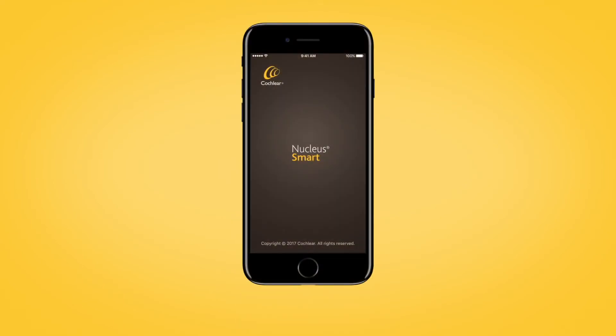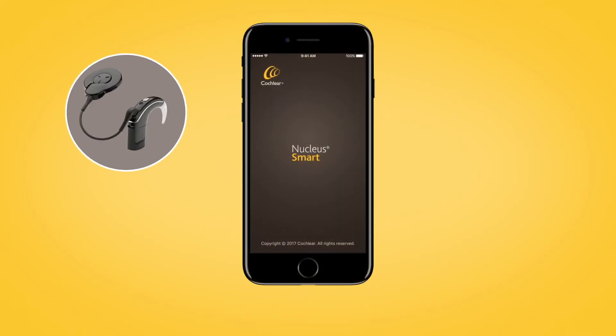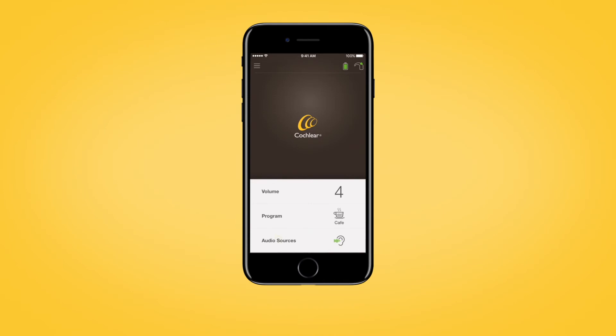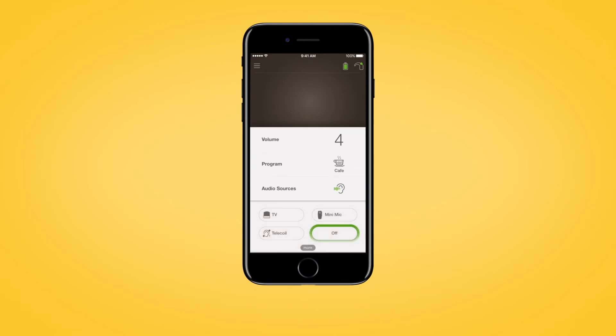When your Nucleus 7 is paired with a compatible Apple or Android device, you can also control streamed audio using the Nucleus smart app. Open the app and tap audio sources on the app home screen. In the audio sources control panel, tap the icon for the audio source you want to use. Tap off to stop streaming audio and return to the previous program.